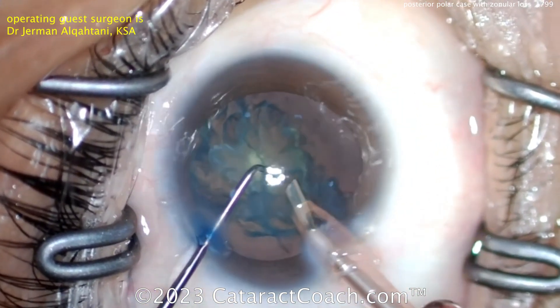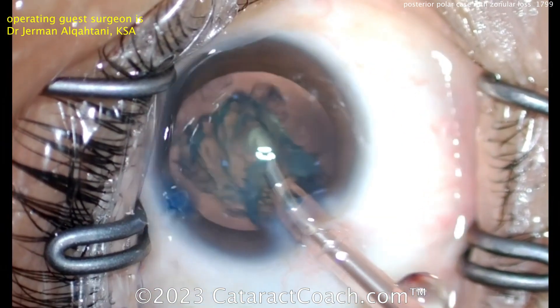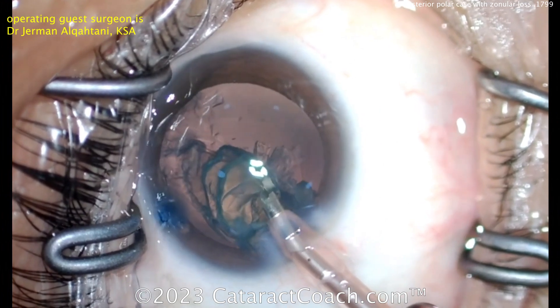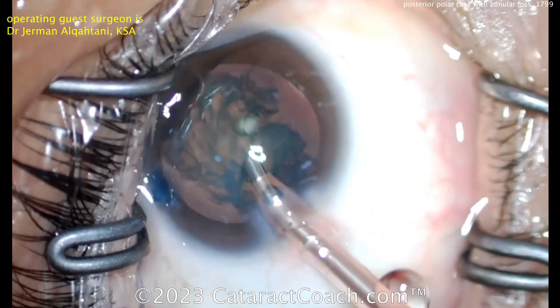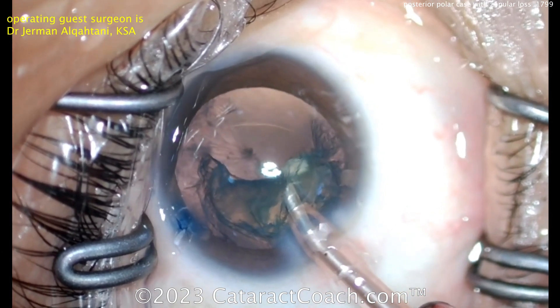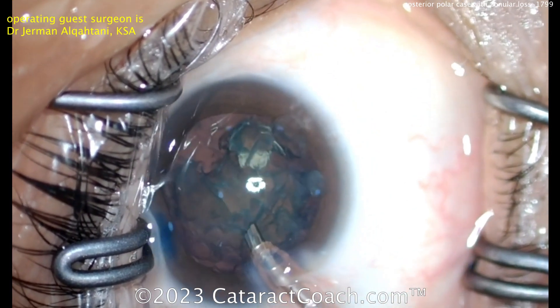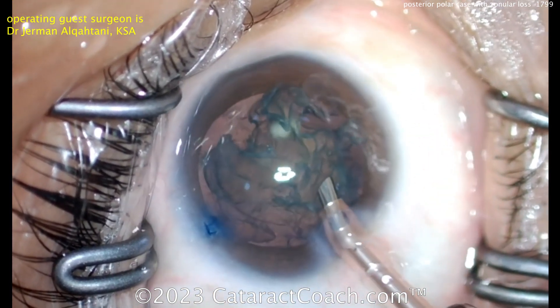Lifting the lens out of the capsular bag and now taking it down nice and easy. As this comes down, you've got to be very careful watching that posterior capsule. Luckily, it looks like the opacity has come up with the rest of that lens material.